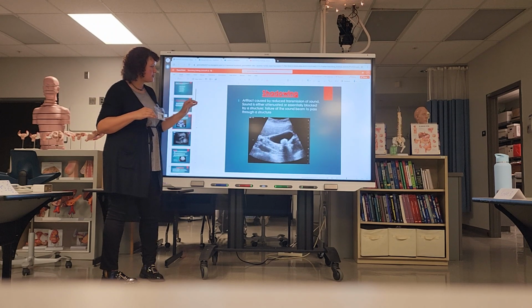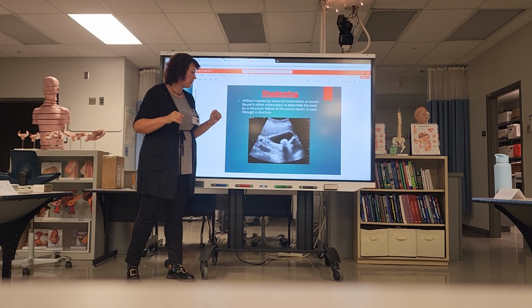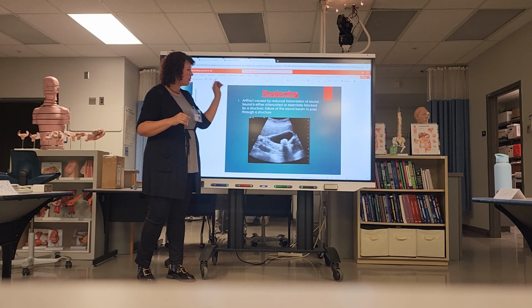Alright, so the first thing that we have is something called shadowing. So this is an artifact, and it's caused by reduced transmission of sound.